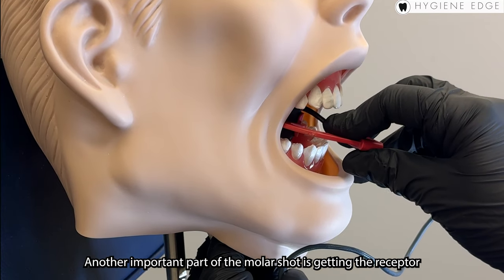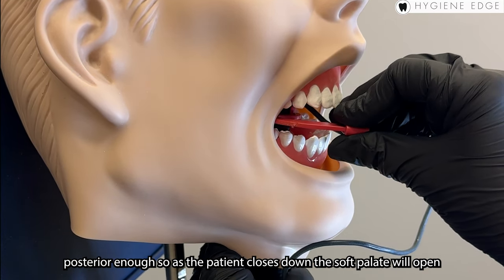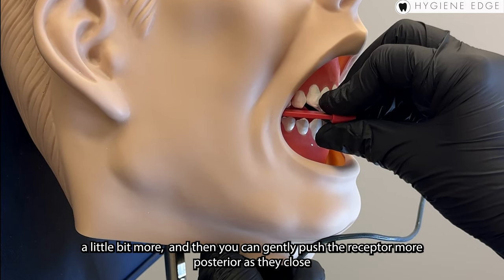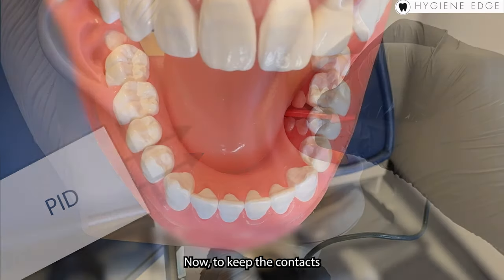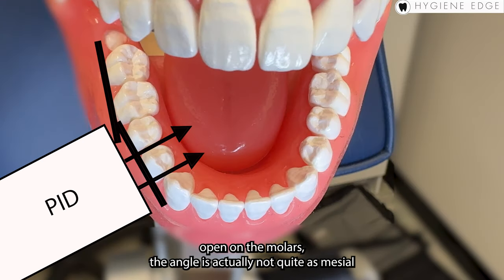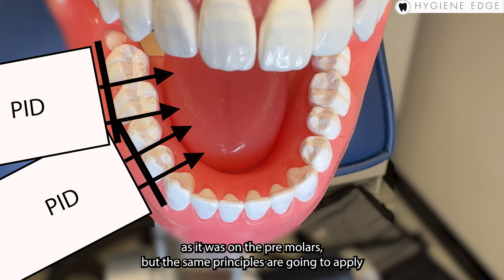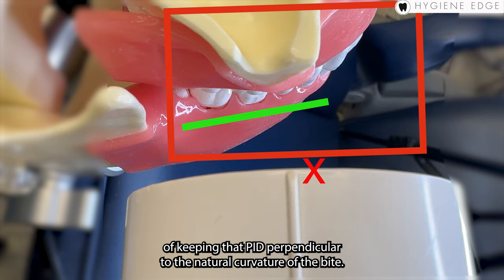Another important part of the molar shot is getting the receptor posterior enough. As the patient closes down, the soft palate will open a little bit more, and then you can gently push the receptor more posterior as they close. To keep the contacts open on the molars, the angle is actually not quite as mesial as it was on the premolars, but the same principles apply of keeping that PID perpendicular to the natural curvature of the bite.